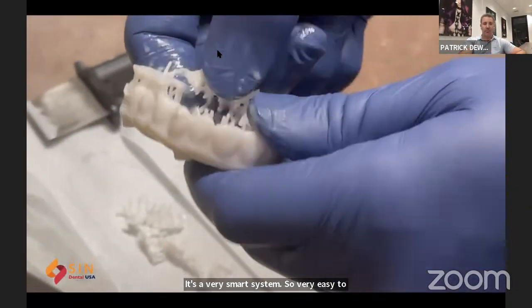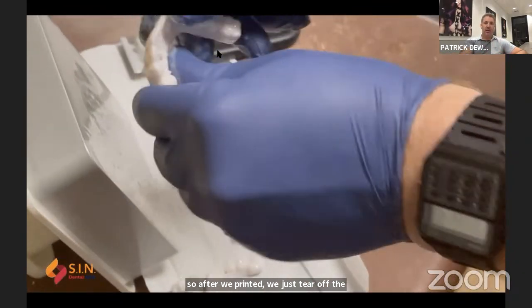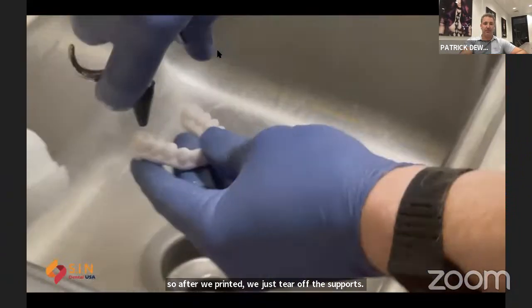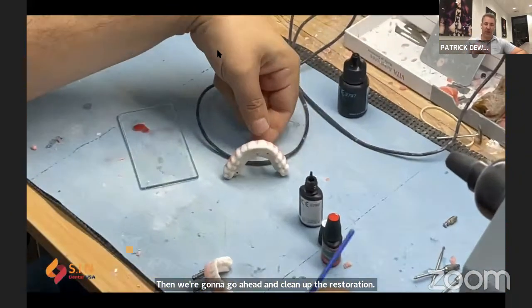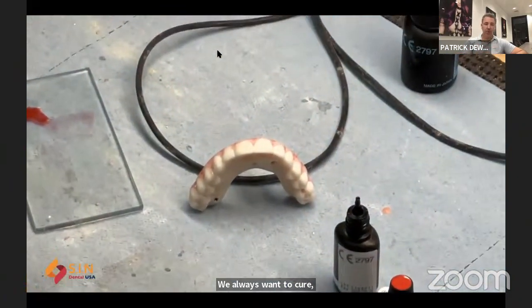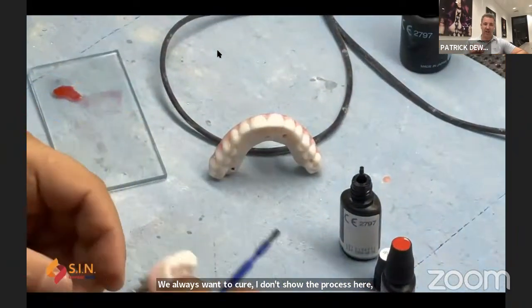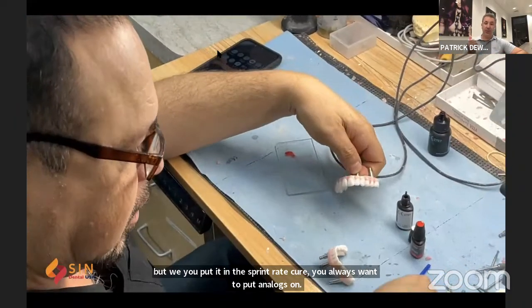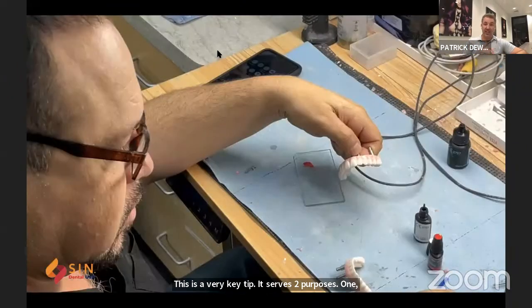All right, so after we printed, we just tear off the supports. Then we're going to go ahead and clean up the restoration. We always want to cure. I don't show the process here, but when you put it in the Sprint Ray cure, you always want to put analogs on. This is a very key tip. It serves two purposes. One, it allows you to hold the restoration when you stain and glaze it.